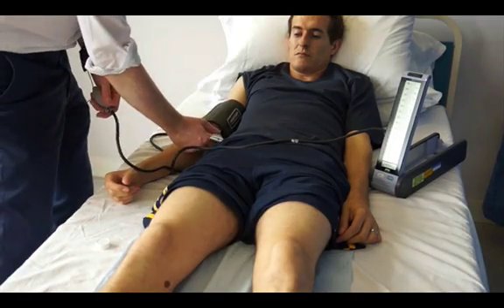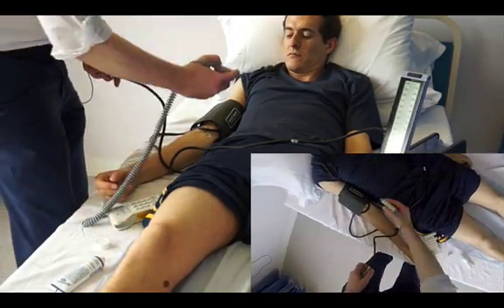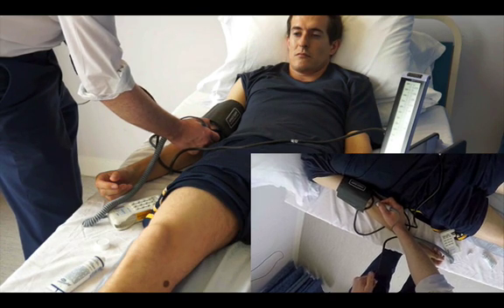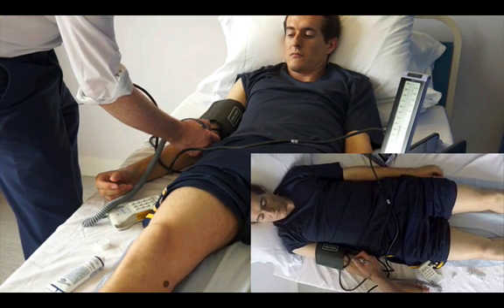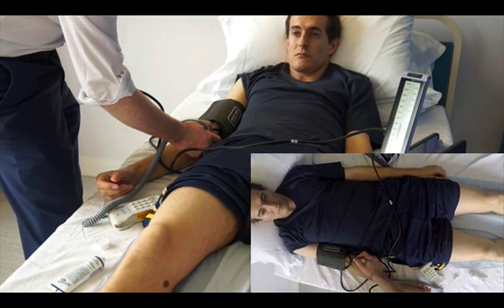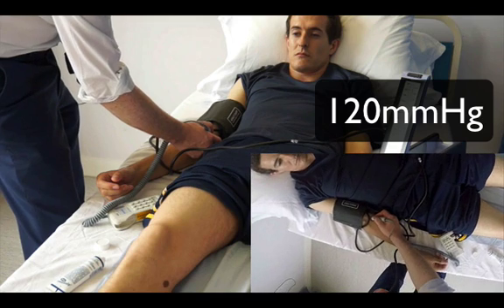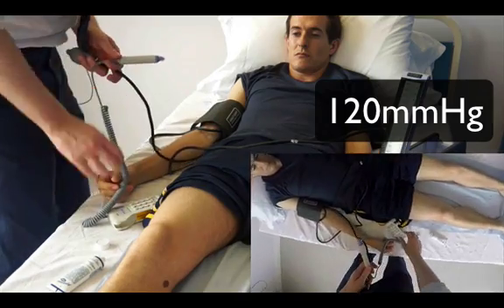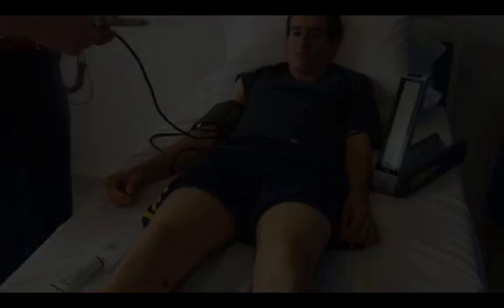We then use the same blood pressure cuff on the patient's arm, with the Doppler probe over the brachial artery. Once the signal is found, inflate the cuff to obliterate it. The blood pressure in the arm is usually a very good representation of the patient's cardiac output, as it's unusual to get stenosis between arm and heart — so always use the brachial artery. Technically you should repeat it in both arms to eradicate any upper limb stenosis, unless the patient has bilateral subclavian stenosis.